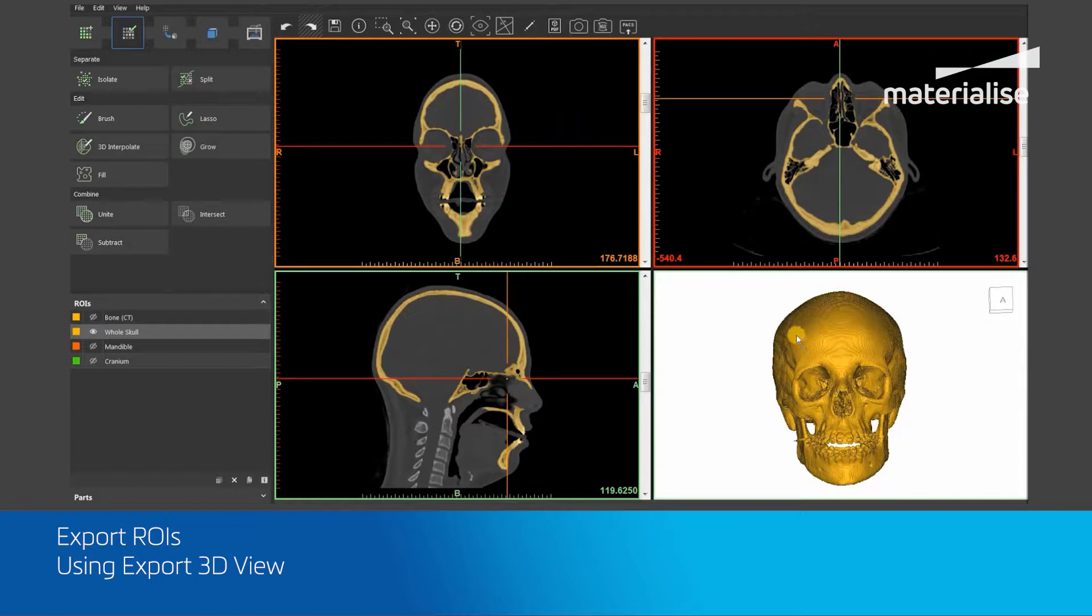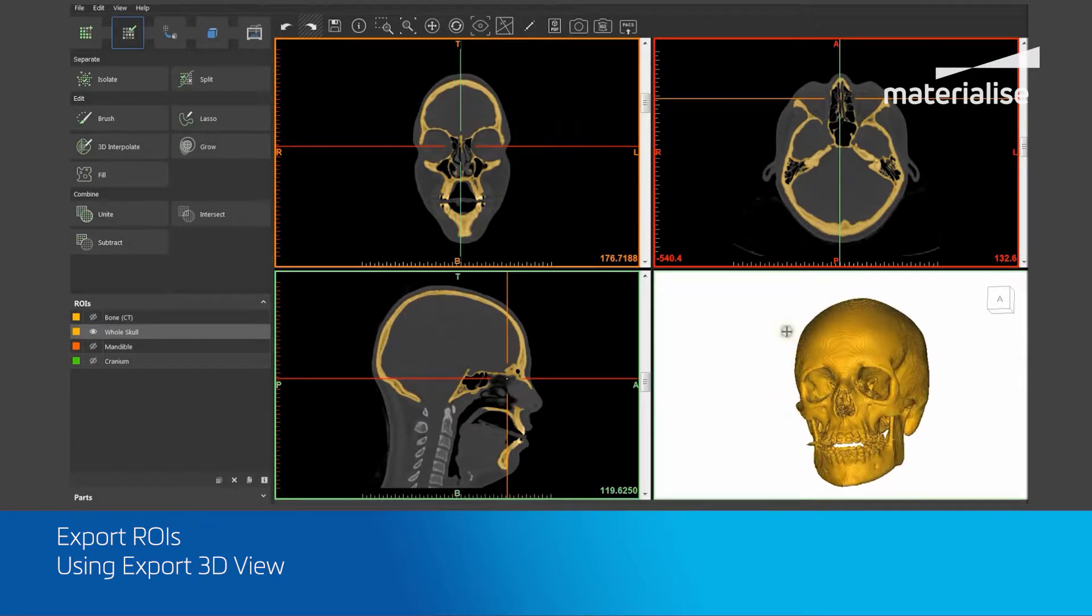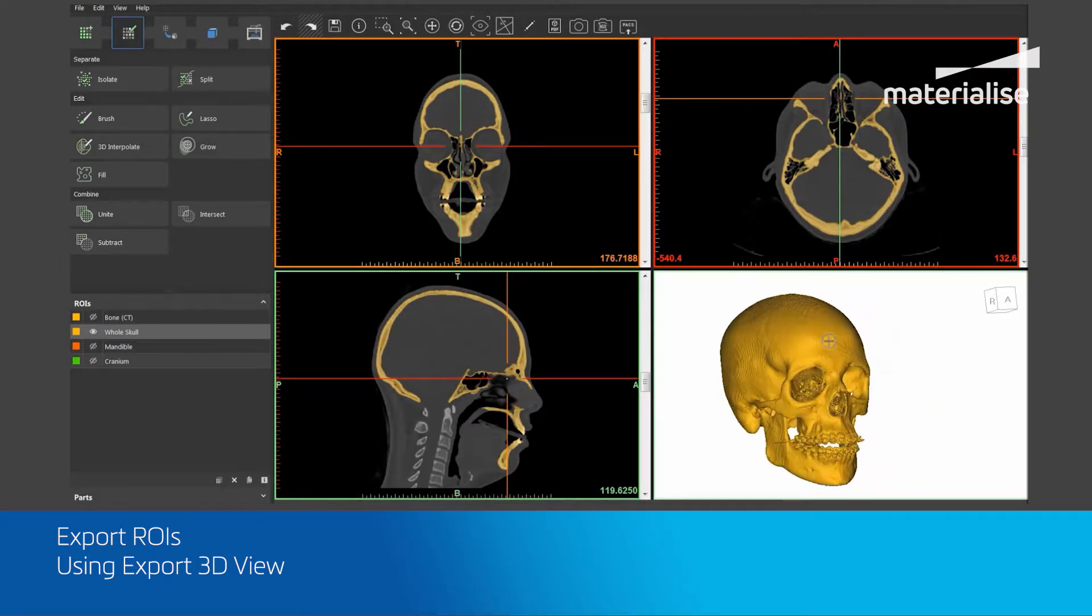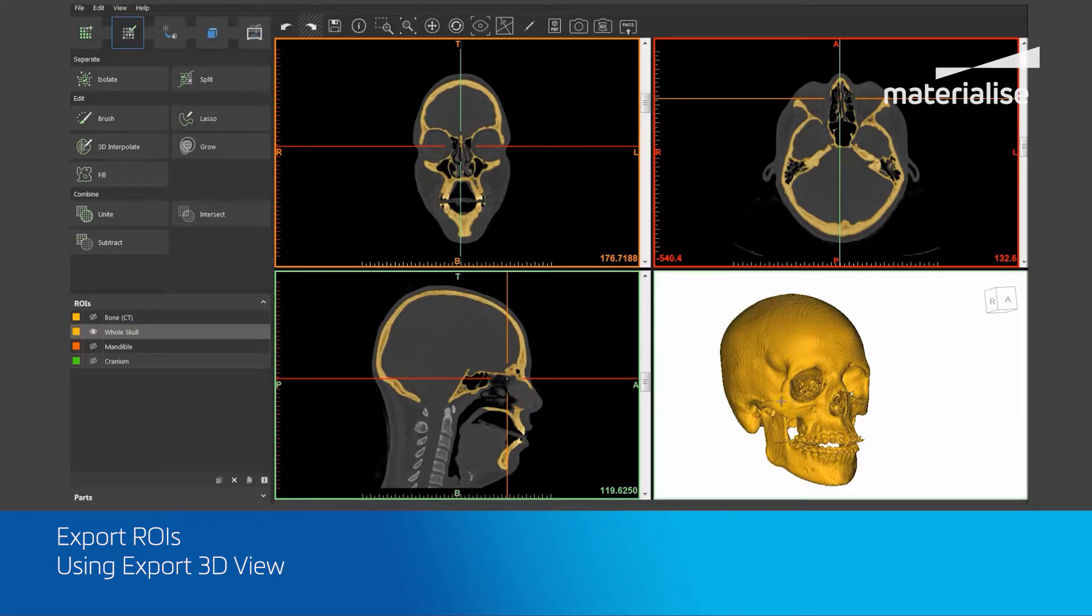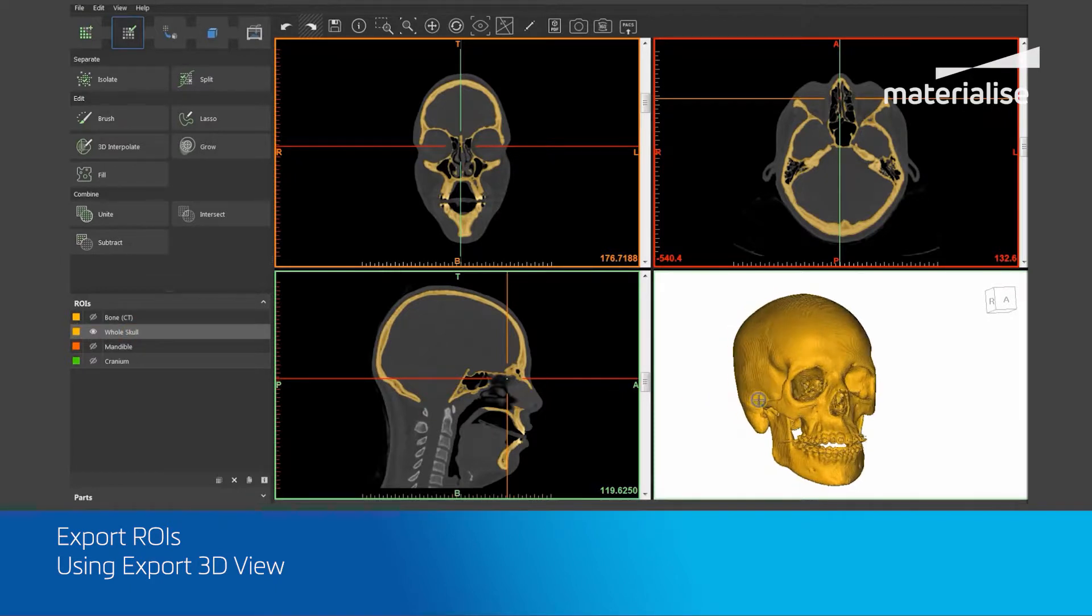You need to first make sure that your required region of interest is displayed within the 3D viewport in the bottom right-hand corner. In this case, my required ROI is the whole skull.